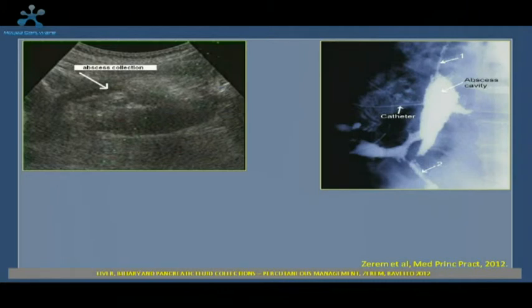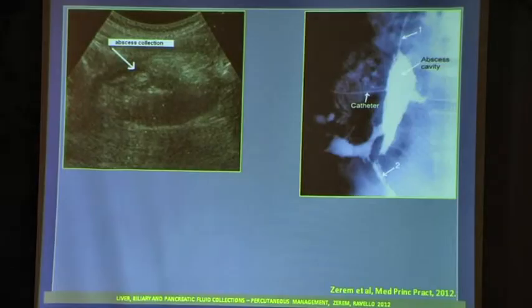The patient was admitted to our hospital in poor general condition with fever, abdominal pain and presence of pus in the stool and by a cutaneous periumbilical fistula. Ultrasound revealed a large abscess collection in the retropancreatic region. A catheter was introduced and pus was evacuated as much as possible.